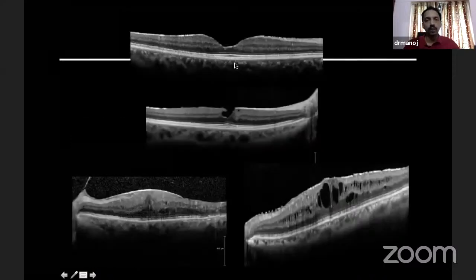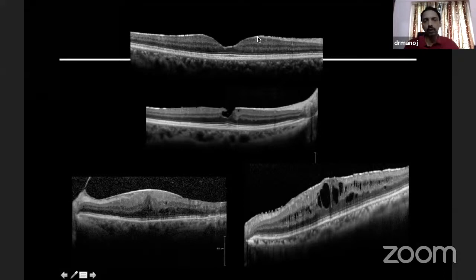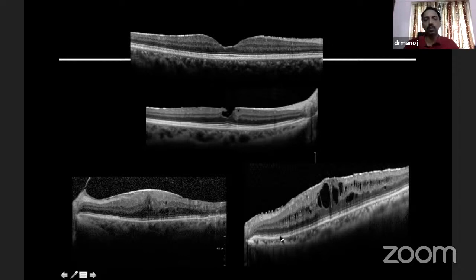You look at the surface of the retina. The other vitreoretinal interface changes could be an epiretinal membrane. The surface of the retina — this is how it should be. Here there is a break in the surface. Here there is a thickening on the surface — this is an epiretinal membrane. If you see carefully, there are some small folds on the surface — these are nothing but internal limiting membrane folds, which may be secondary to epiretinal membrane.